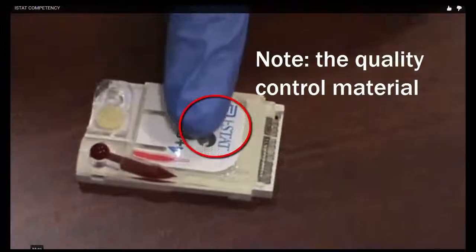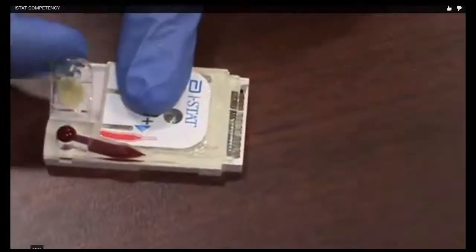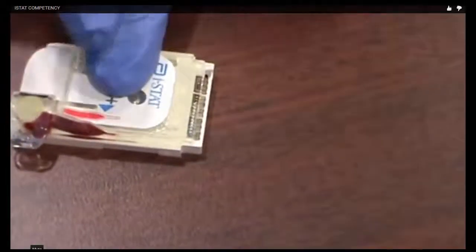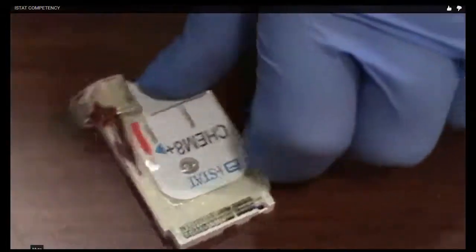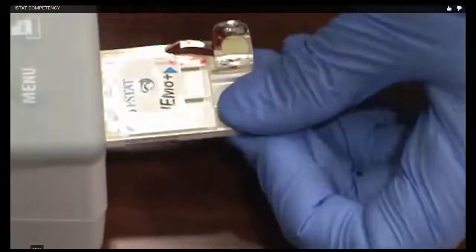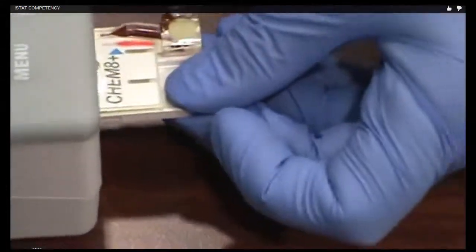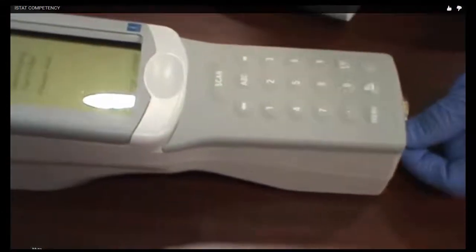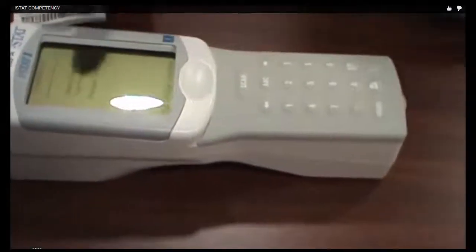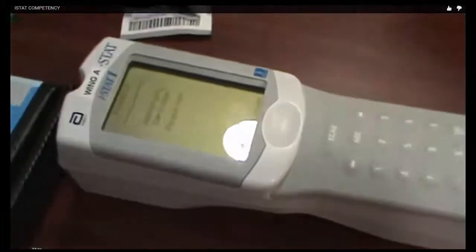All right, what you're going to do, if you hold your finger here, this little flap will go over. Don't worry if you have a little mess, it doesn't matter. What you want to make sure you have is some blood running into this little capillary area here. Once you get it all closed up, there's kind of a little thumb piece here you can grab to insert it. At the end, the same place where we inserted the simulator, you'll hear it click. And 2 minutes to result. Don't try to pull the cartridge out. Once it's in there, it's in there. You'll hear it making some noise, and it's telling us that it's identifying the cartridge, and it's asking you to please wait.